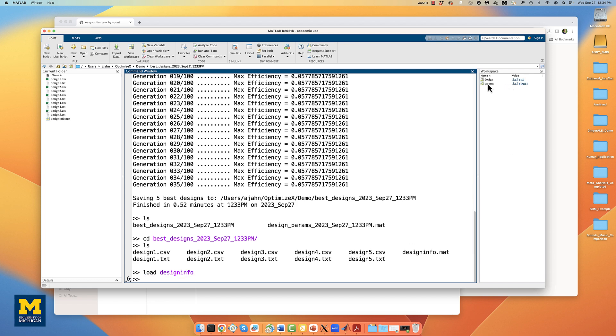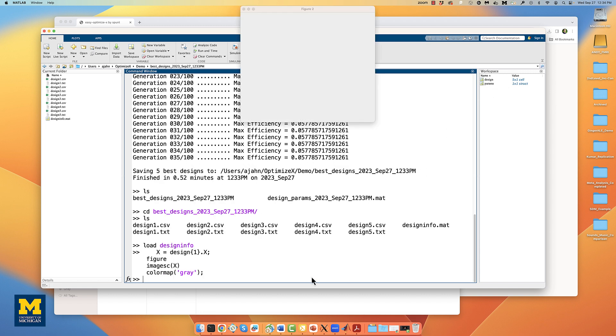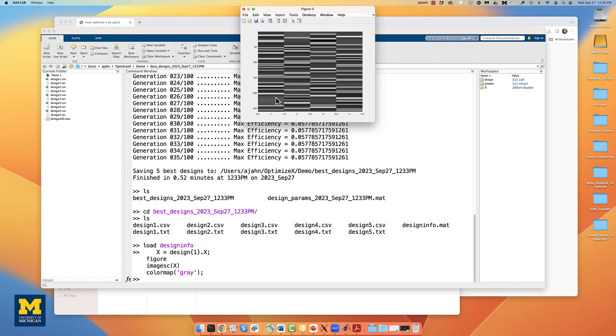This structure contains two variables, design and params. They contain information for each of the designs that you generated. In particular, the design matrix is stored in a field called x, and here's the code you can use to load the first design in that particular cell, and then display it in a figure minus the intercept term that you saw previously.